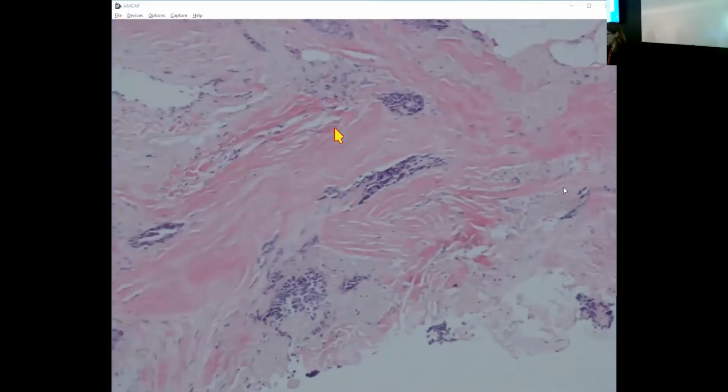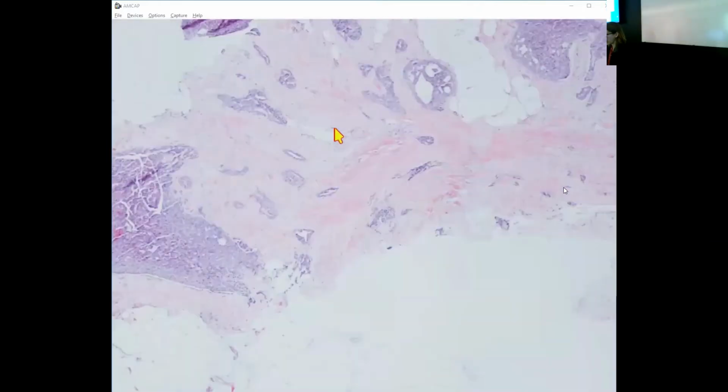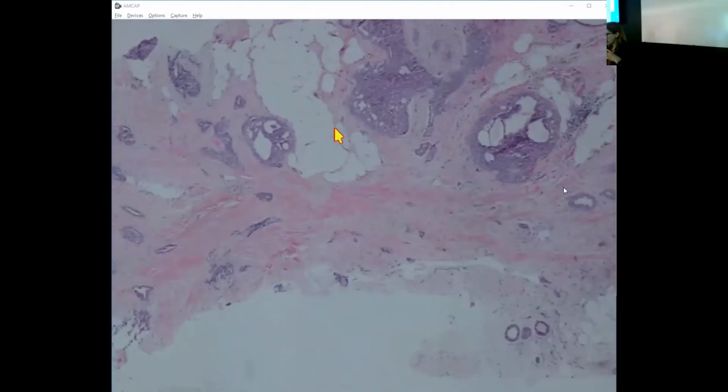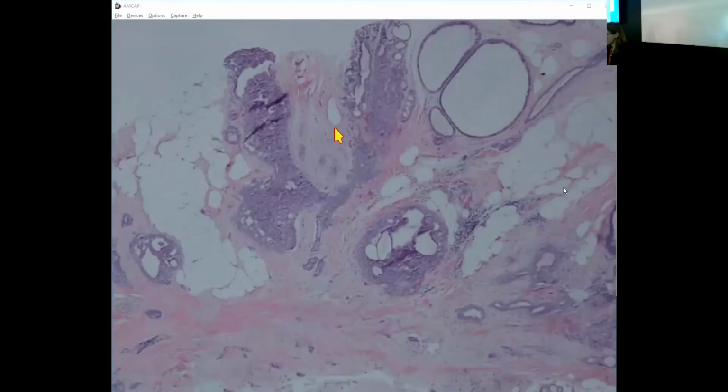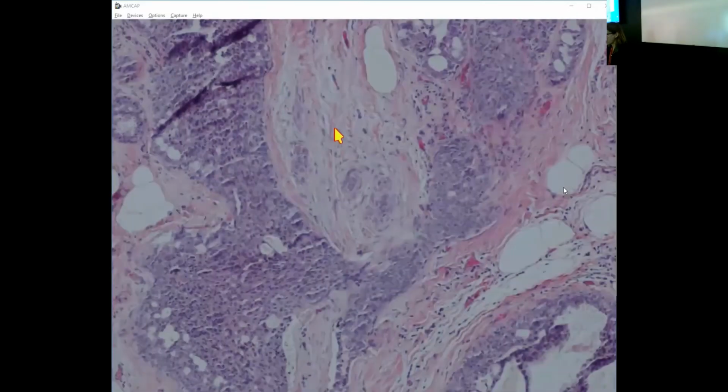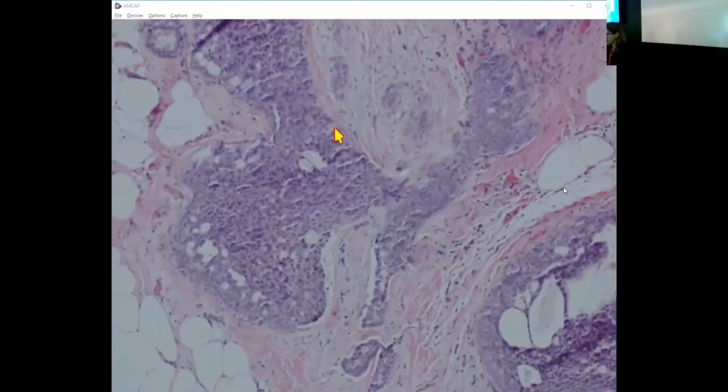So there's this sclerosis. There are these glands that are kind of percolating through. It doesn't have that sort of nice central nidus that we just showed of the radial scar. It's more dispersed and irregular, isn't it? But it looks sort of stellate, and it looks like there's just a larger central area of fibrosis. Yes. And you're right to notice the usual ductal hyperplasia, because the fact that we've got something benign going on in the epithelial proliferation would make me favor it not being invasive carcinoma, right?